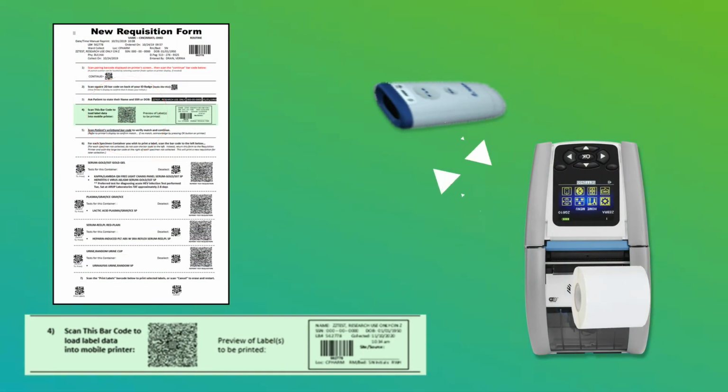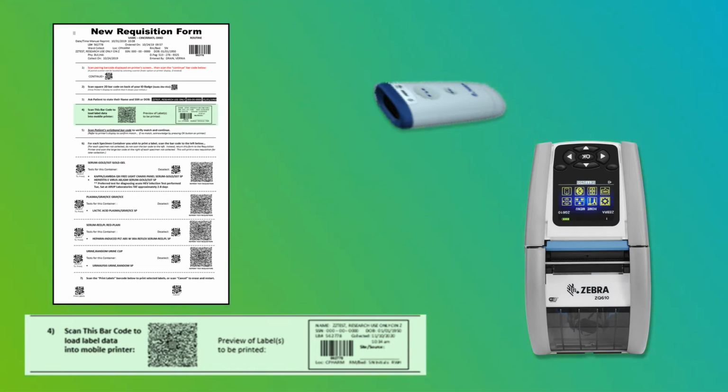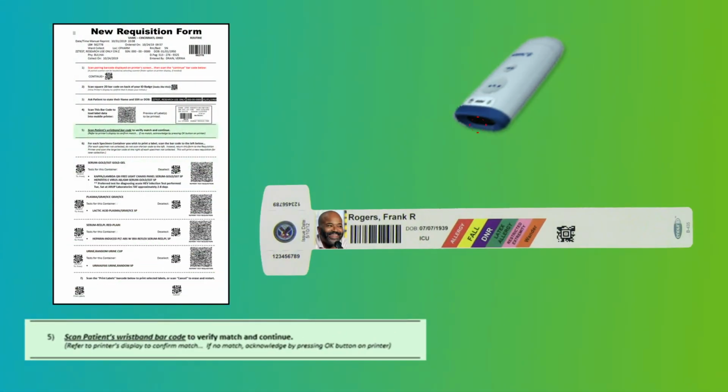In Step 4, the 2D barcode is scanned, loading the lab order data into the Zebra mobile printer. This data contains all the information needed to produce the new bedside printed specimen labels. In Step 5, the patient's wristband is scanned to electronically verify that this is the correct patient. If the patient's wristband ID does not match the patient ID in the lab order, then specimen labels cannot be printed. If they do match, you proceed to Step 6.